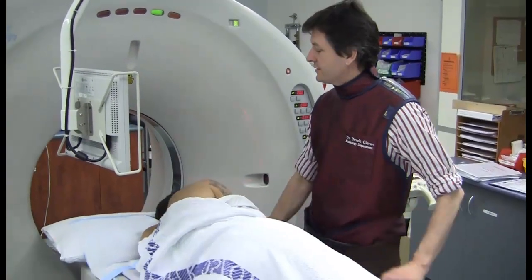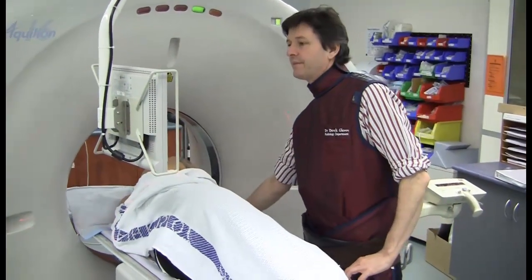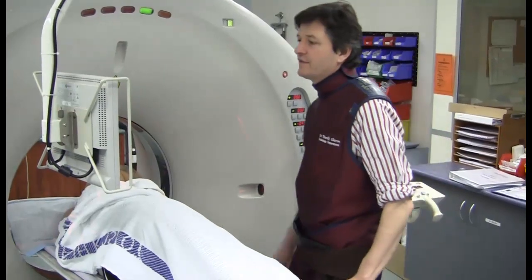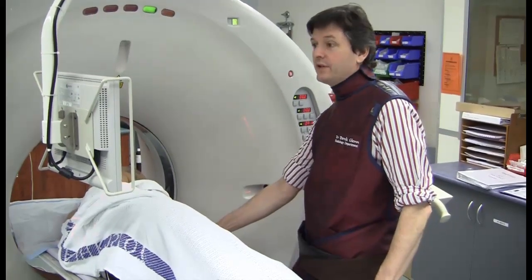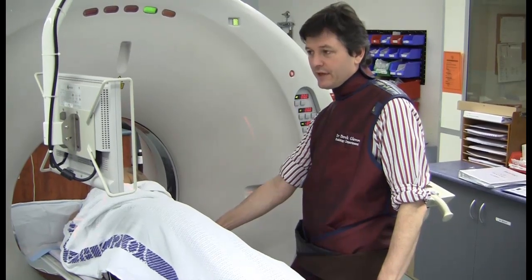We're just doing a C8 nerve root block and plot. The cervical nerve root blocks are officially tricky to do. The problem is the proximity of the vertebral artery.